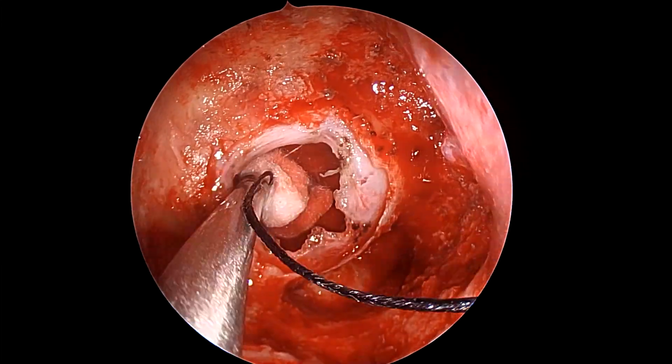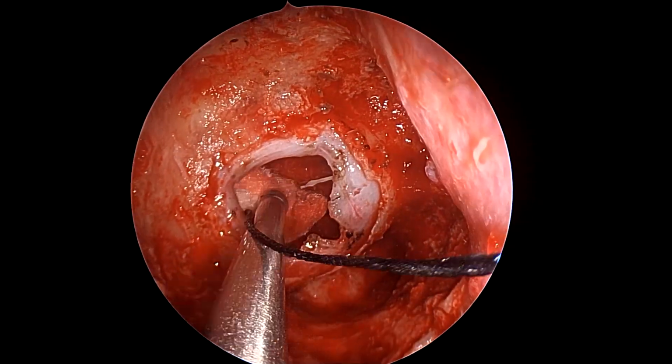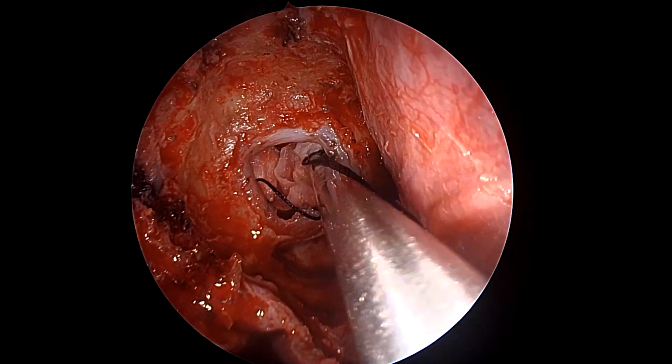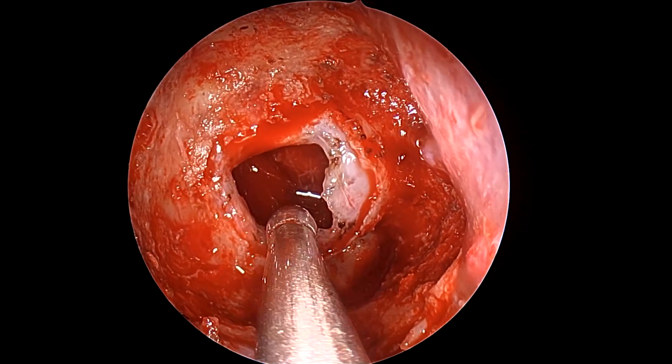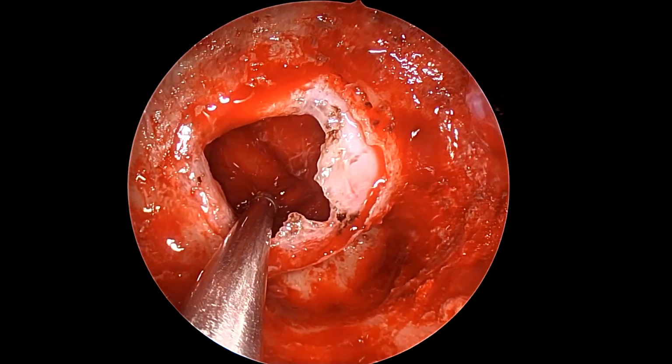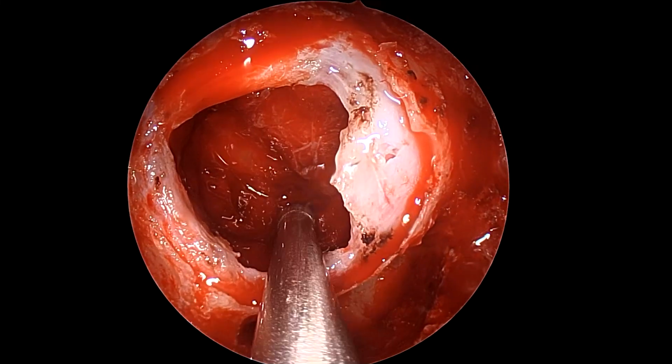Once a lot of it has been done, we take a little pause to keep a small cottonoid inside this sellar cavity for achieving some hemostasis, before we take a call as to whether some more of the tumor has to be removed, or we can call it a day, followed by closure of this defect.